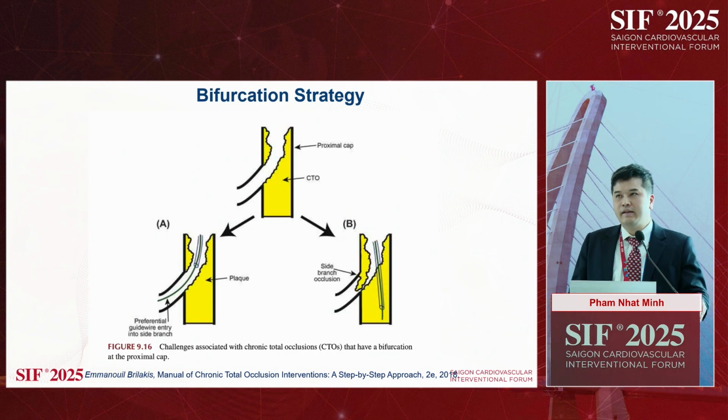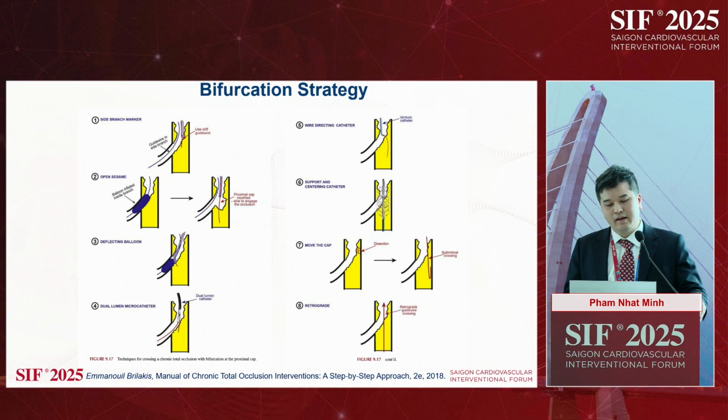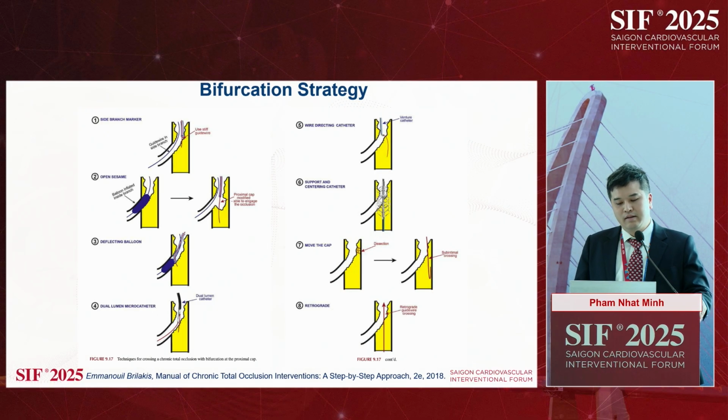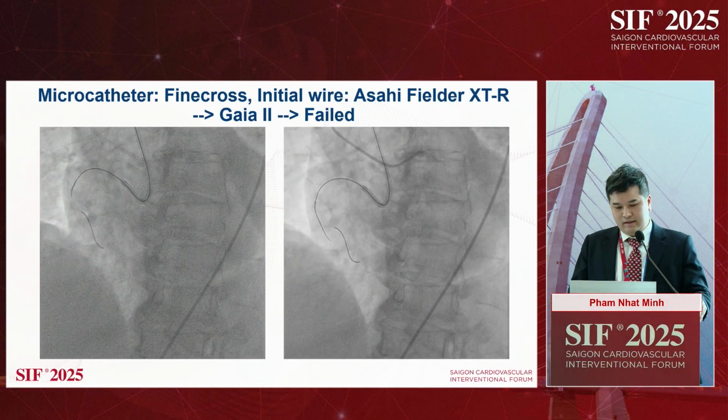In this case we also have a bifurcation. I'm sorry for the poor quality of the video, maybe because of the machine.